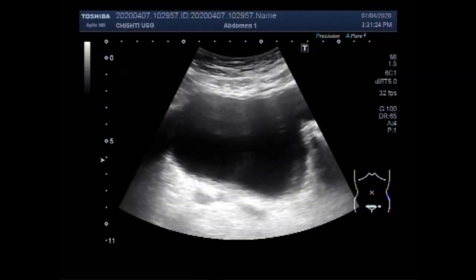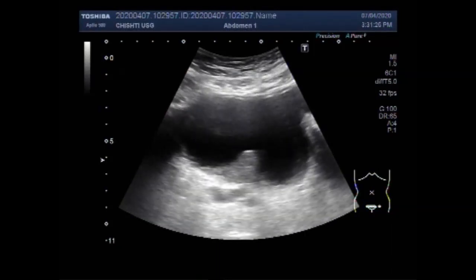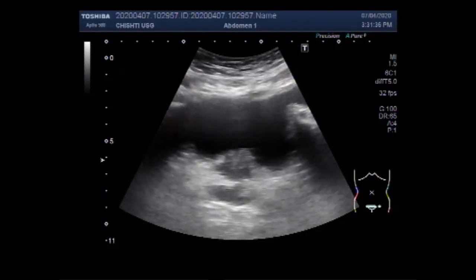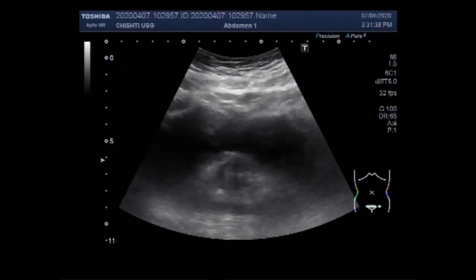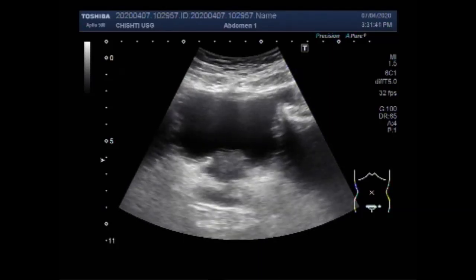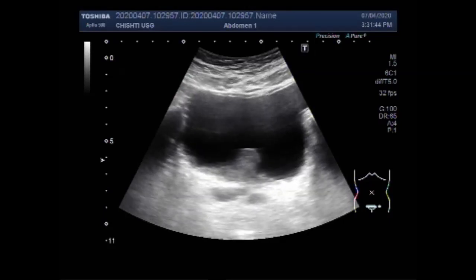This ultrasound video shows a case of enlarged prostate. A male patient has a growth in the urinary bladder. You can see the urinary bladder and the prostate, which is enlarged.